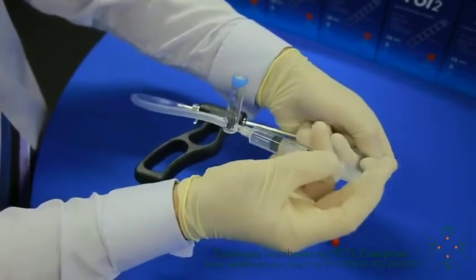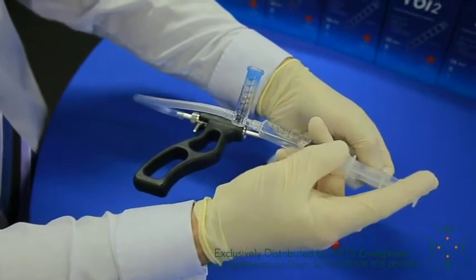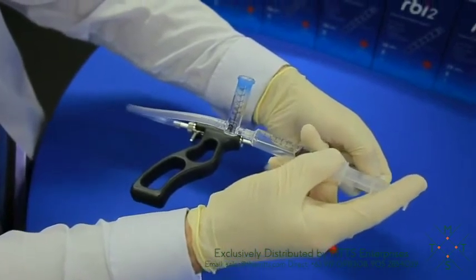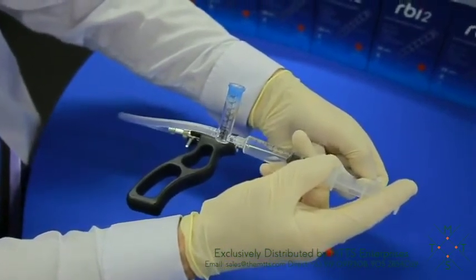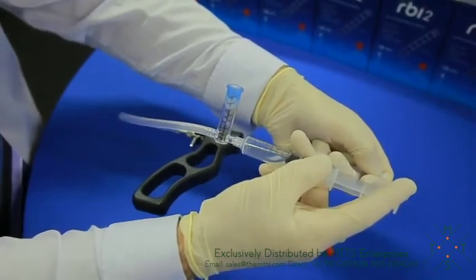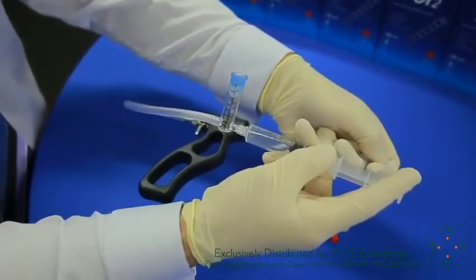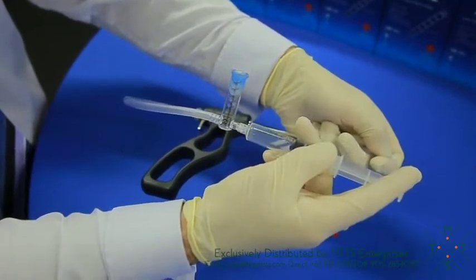You'll wait for the manometer to cause a reaction, and the manometer will hold. You'll notice there's no loss of suction because of the independent seal. So there's no rush. It's very important that at this stage you're concentrating that you're not actually pushing hard against the mucosa.